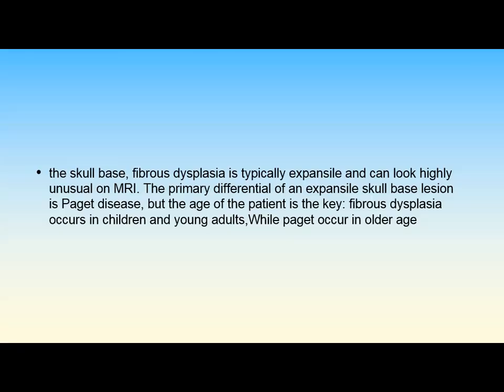The skull base. In the skull base, fibrous dysplasia is typically expansile and can look highly unusual on MRI. The primary differential for an expansile skull base lesion is Paget disease, but the age of the patient is higher in Paget disease.